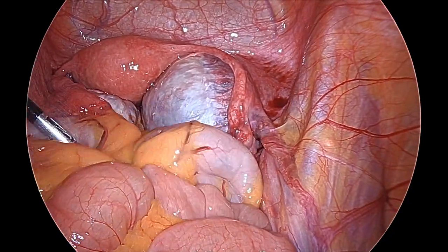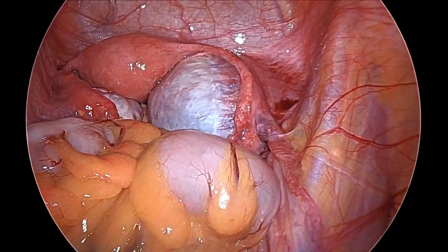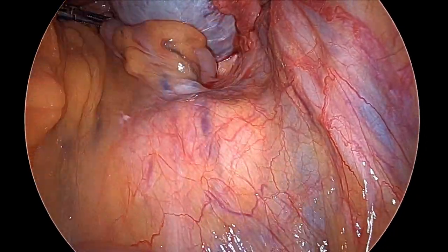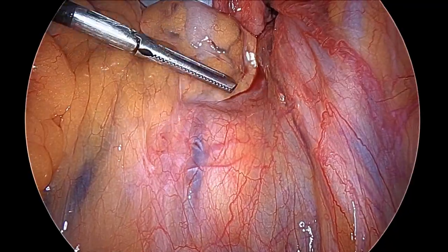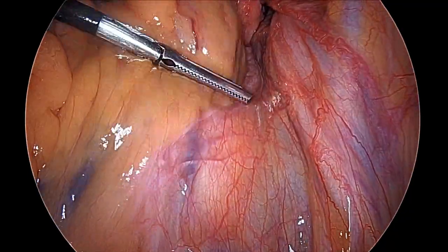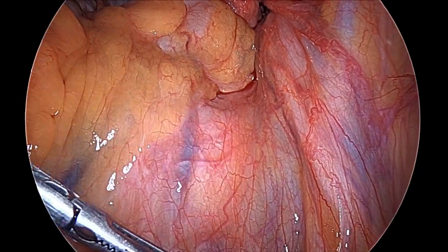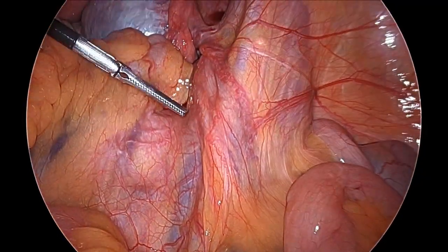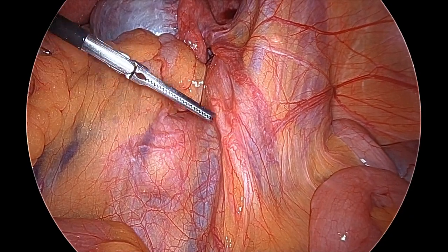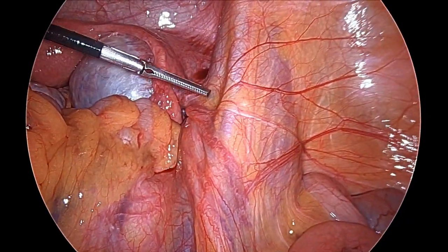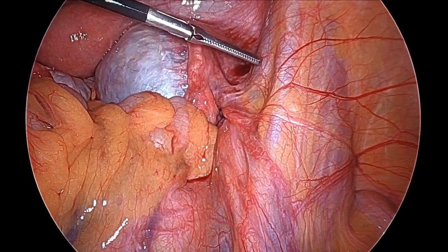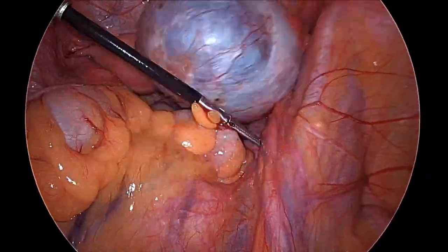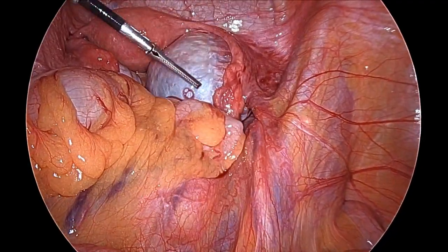We can see the rectum and the small bowel has been moved up. The sacral promontory is visible and in the middle we can see the median sacral vessel. This is the hollow of the sacral curve. Here is the aorta and the common iliac vessel, internal iliac, and the ureter with visible peristalsis. This is the external iliac artery and vein, and this is the infundibulopelvic ligament. We can see the large ovarian cyst on the right adnexa.